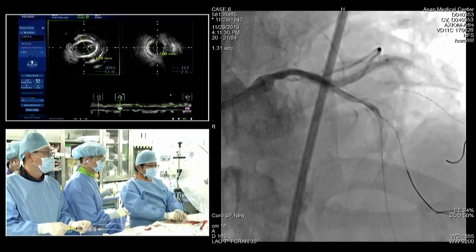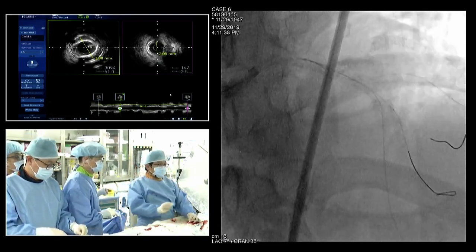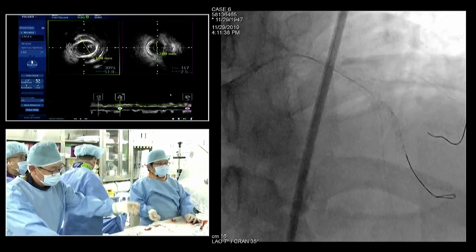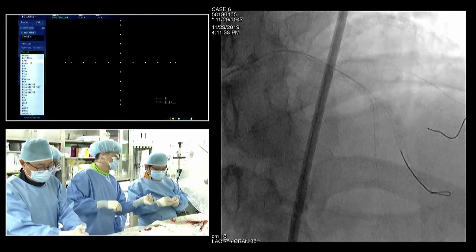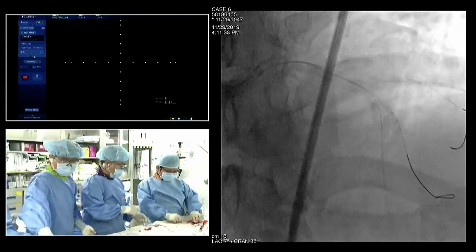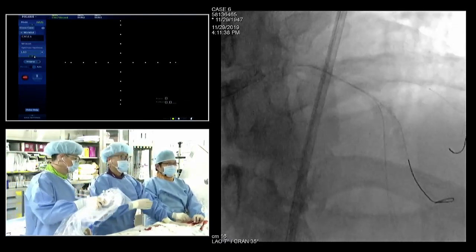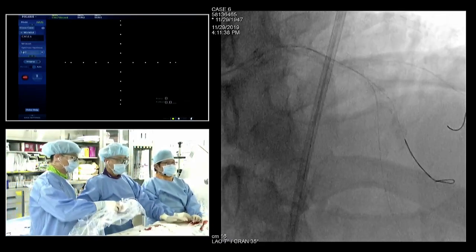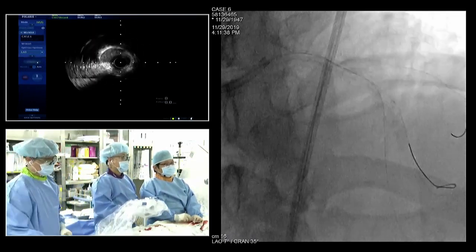Definitely we have to do the diagonal. You may need to do it, yes. Please give me the stent. IVUS. Yes, I think so. This diagonal will take almost 20 minutes. I'll use an assist. It's going to take some time, you may miss the dinner. It's going to take another half hour, 40 minutes.